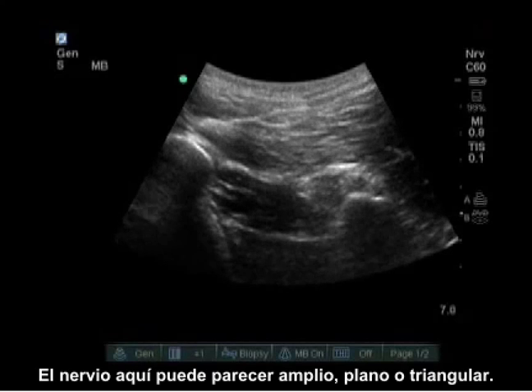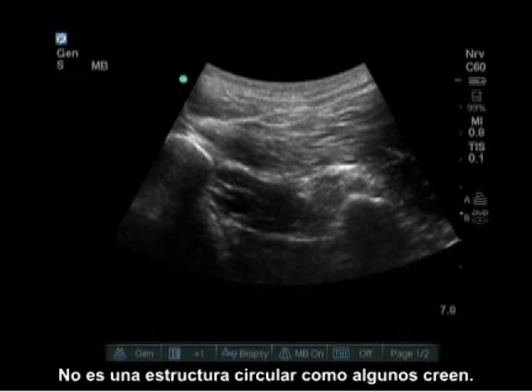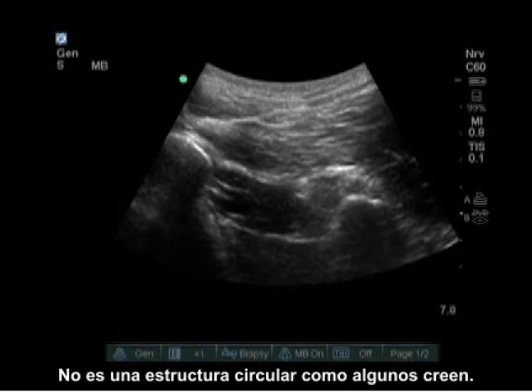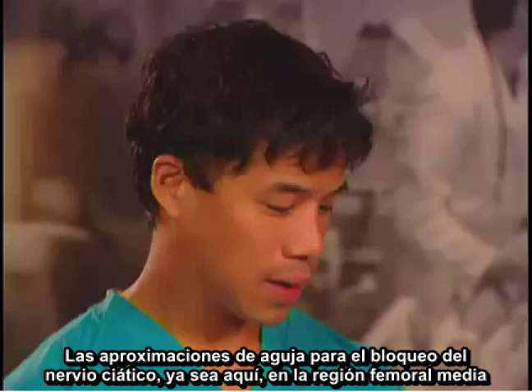The nerve here can appear wide, flat, or triangular. It is not a circular structure like some people imagine.